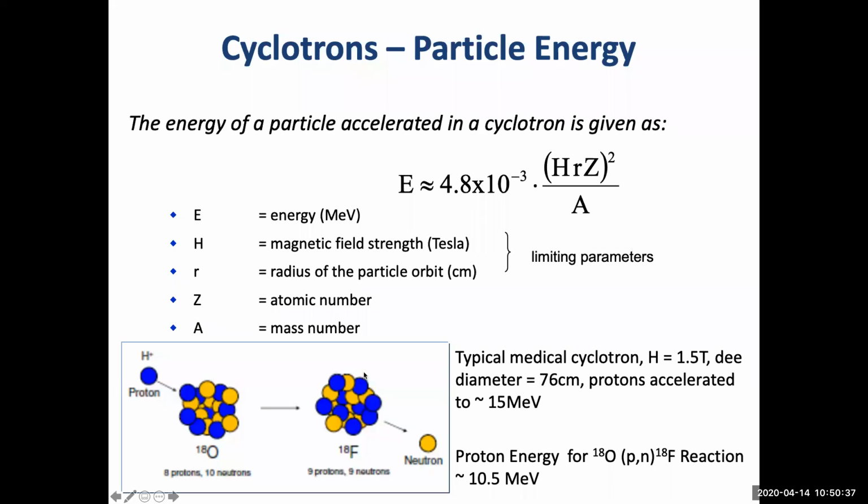So now it is a radioisotope, an unstable element, that can be used for imaging in positron emission tomography. And this is always followed by neutron emission in the accelerator. So always we have neutrons in the vault of the cyclotron. So this is the principle of the cyclotron: a charged particle hits the atom, makes it an isotope, and we use it for imaging.